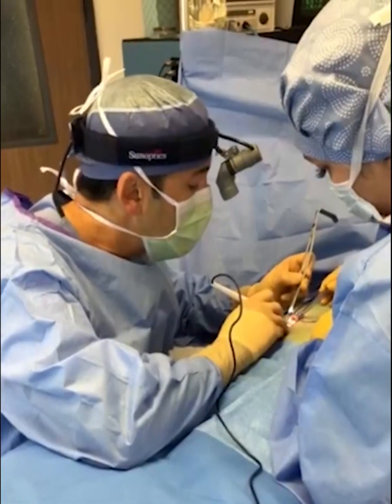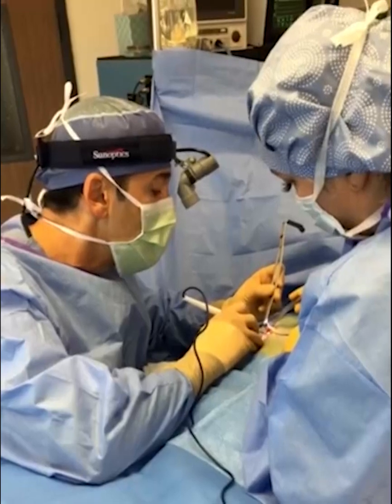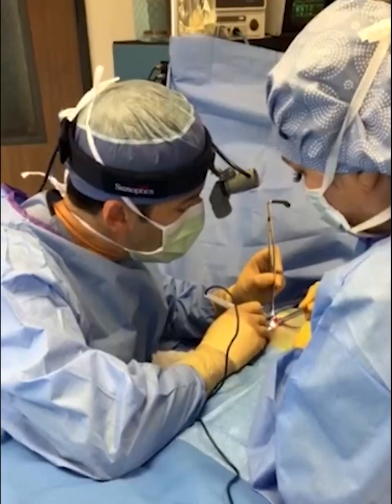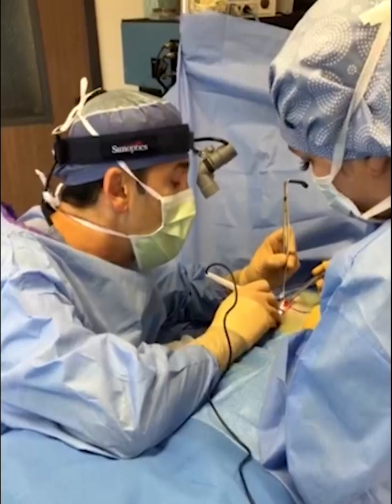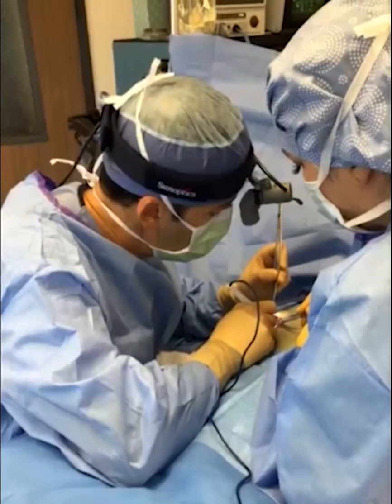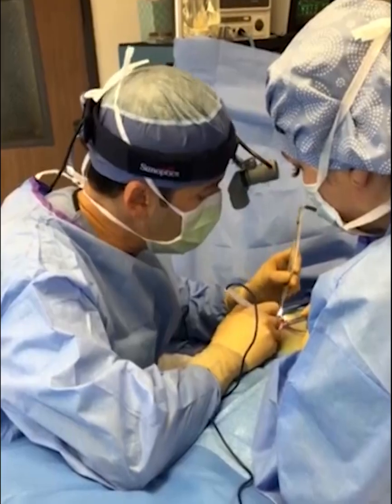All right, so we're already at the muscle now. And this is the pectoralis muscle. So what we're doing right now is just releasing the pec muscle inferiorly so that we can get underneath the muscle and then do our pocket dissection for the implant. So we'll catch up again in a little bit.